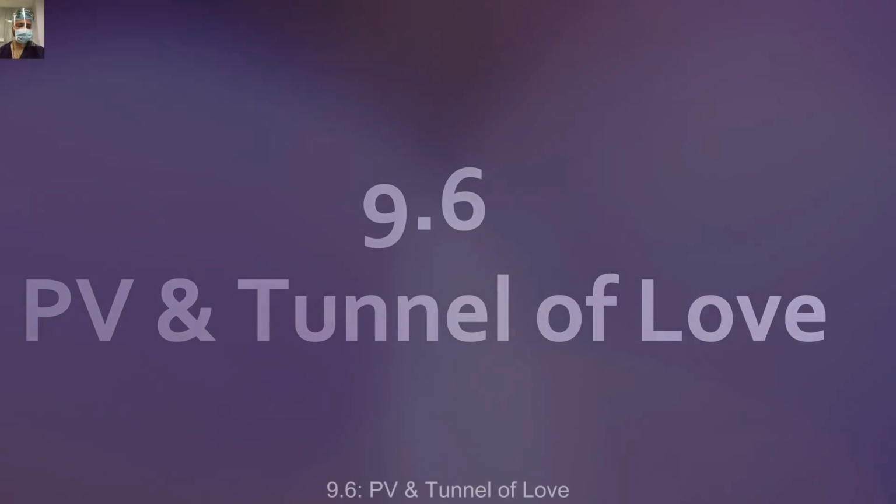Fifth part of this video, that is the second last part. In this, we will dissect the GCT, and dissect the infrapancreatic SMV. So this will be part 9.6 of this video. In this part, after ligation of the GCT, we are trying to create the tunnel of love and dissecting the infrapancreatic part of the SMV.